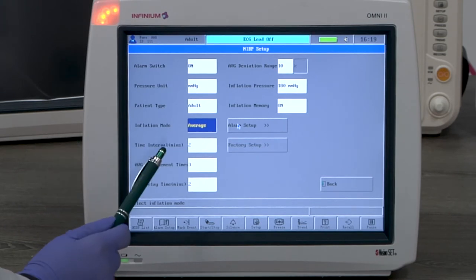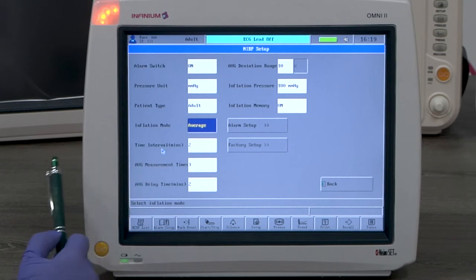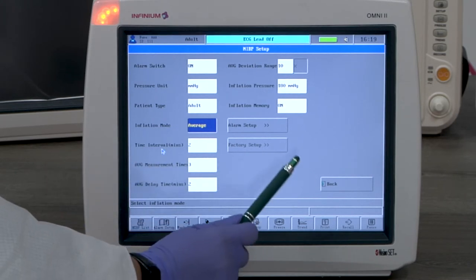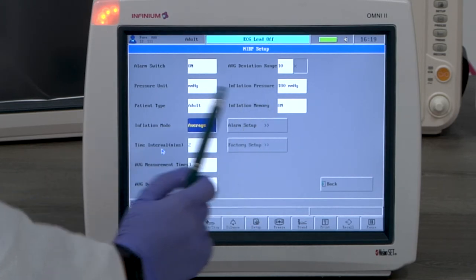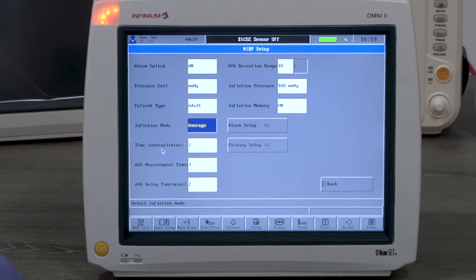Another set of measurements start according to the set interval. The inflation memory's default setting is off. When it's on, it remembers the previous measurement and adjusts the initial inflation accordingly.